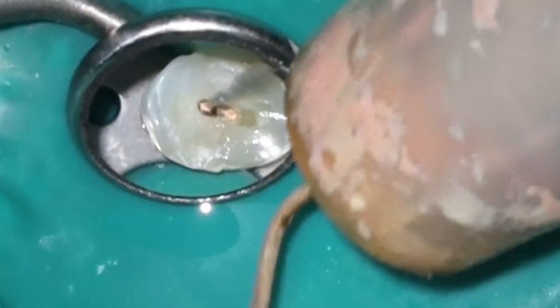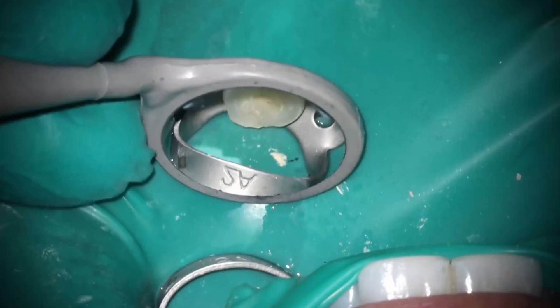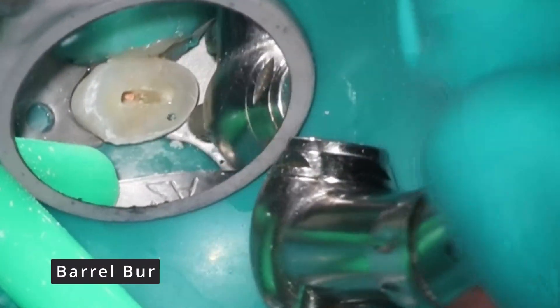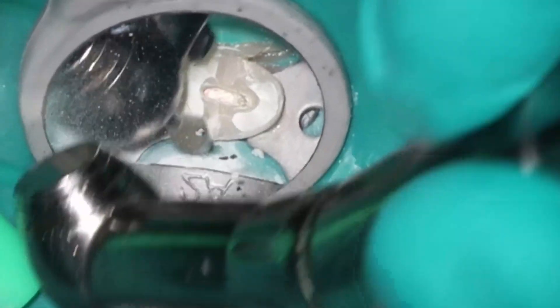Doing a little final cleanup here, making sure those orifices are clean. Getting that nice and cleaned off, then the final picture. One thing I do on these cases where I flatten it off — I take the barrel burr and go around the side to make sure all those right angles are nice and smooth. Very demure, very mindful — my staff said I had to use that in a video, so there you go. I'm going to smooth off those right angles so it's not sharp on their tongue.